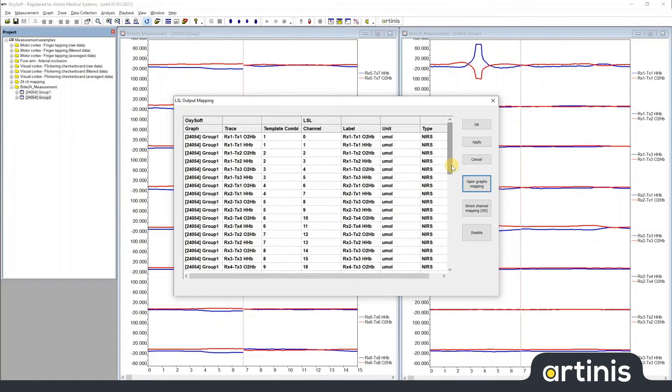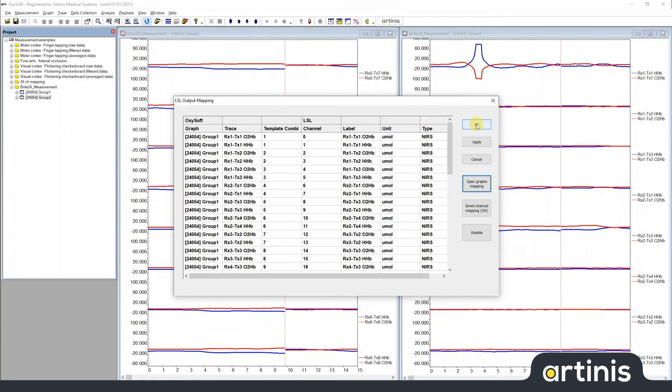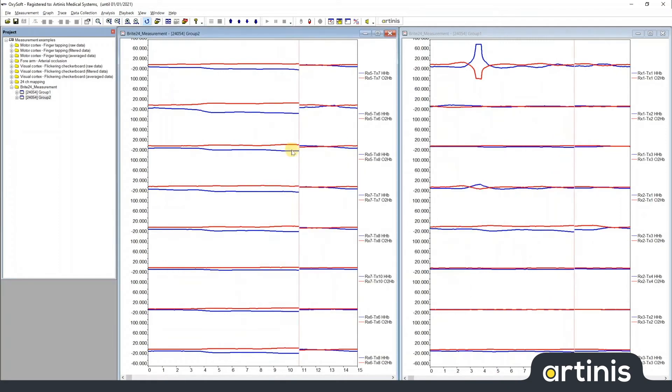To enable the stream, you simply click OK in the LSL output mapping window and the stream will be running.